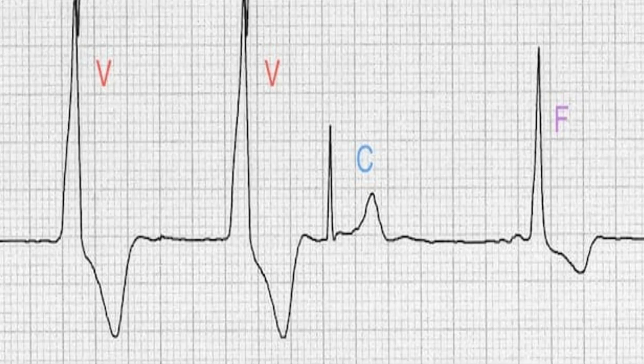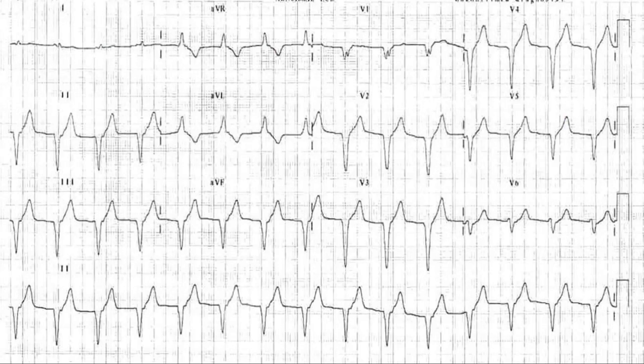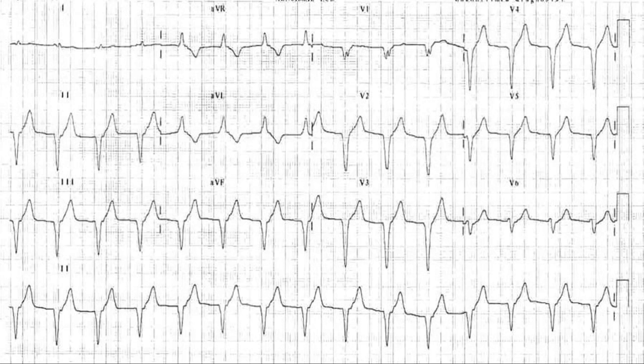Now, here in this strip, the ventricular beats, the captured beats and fusion beats are shown in zoomed image. So, here is another example of accelerated idioventricular rhythm where you can see that there are broad complexes at a rate of about 90 beats per minute but there are no P waves. So, by definition, if any rhythm which is a ventricular origin and it lies between 50 to 110 beats per minute, it is called accelerated idioventricular rhythm.